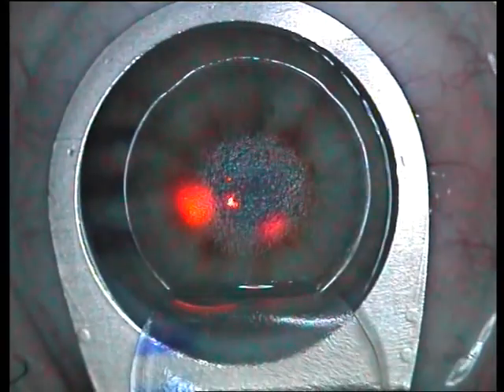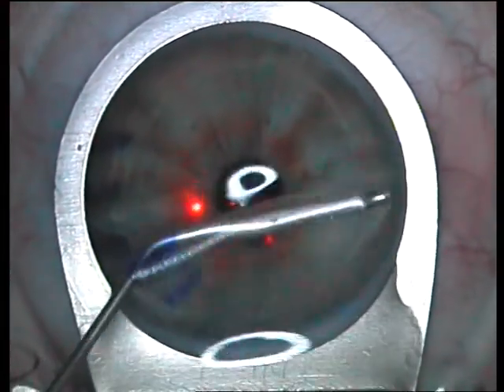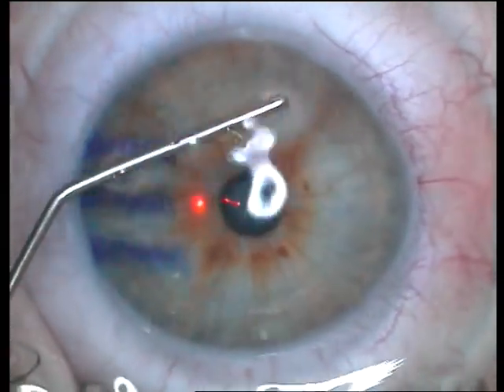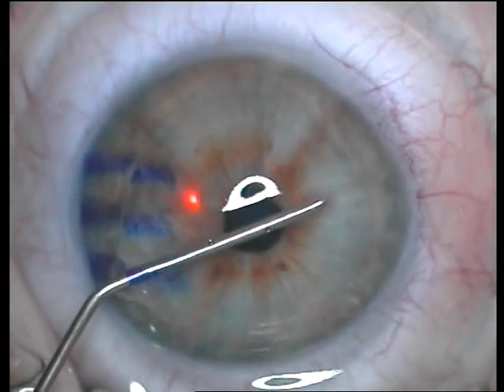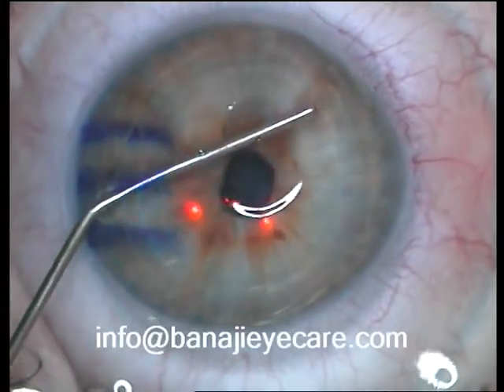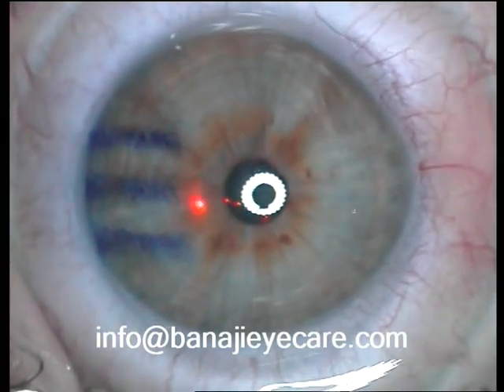The flap is now washed. This is another variant of the Banaji LASIK cannula — it's a straight cannula; the curved cannula is more commonly used. Wash under the flap and remove the cannula. Check for alignment and the operation is through.